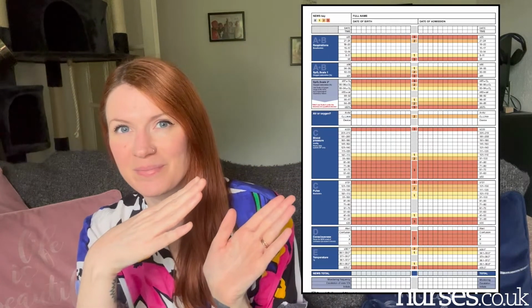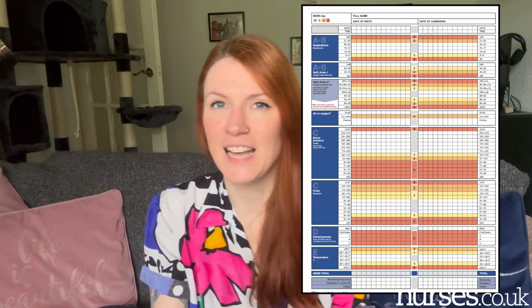Research shows that observation monitoring, so doing that complete set of observations or vital signs on your patient, can literally be life-saving, because usually the first thing to go is something going AWOL in the body, which is going to trigger the observation charts. This is why we have something called the NEWS chart, or the National Early Warning Score Chart 2, which is a very specific chart which I'm going to show you here. You may have seen this out in practice already, and you may have already used it. This chart will be reviewed over the 24-hour period.